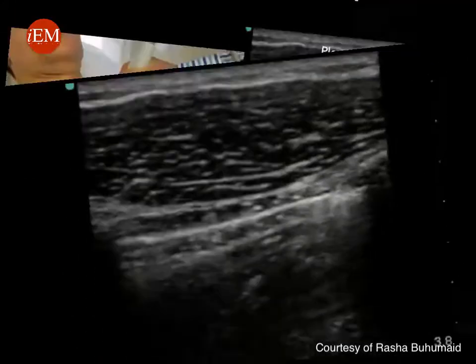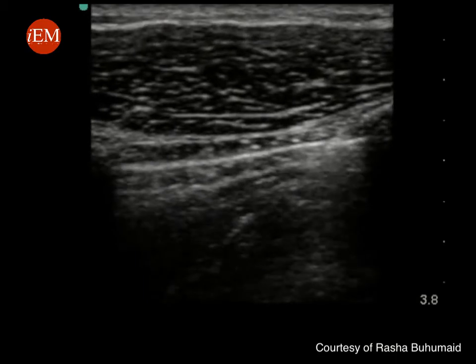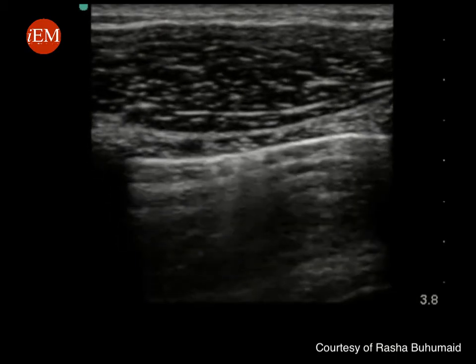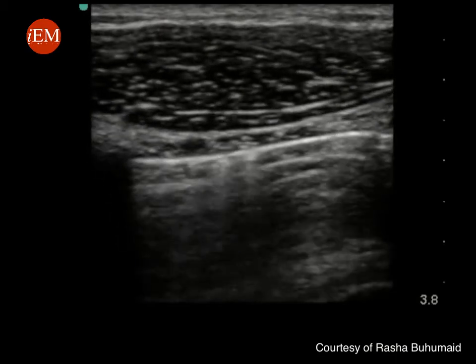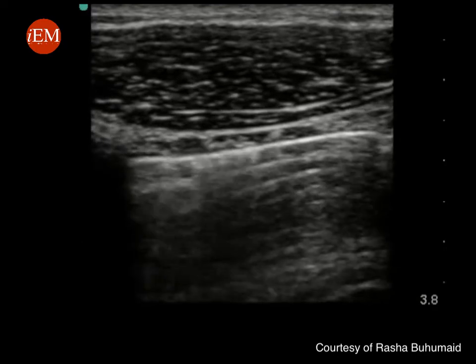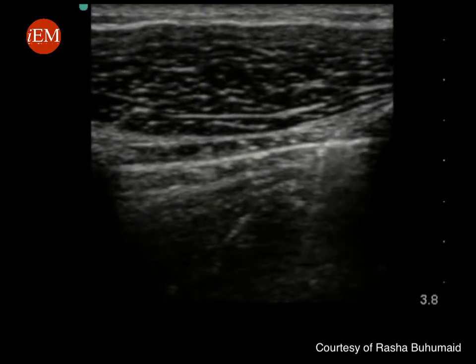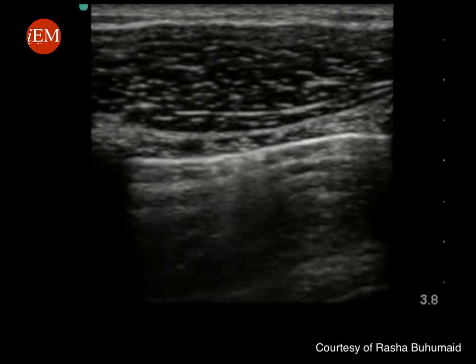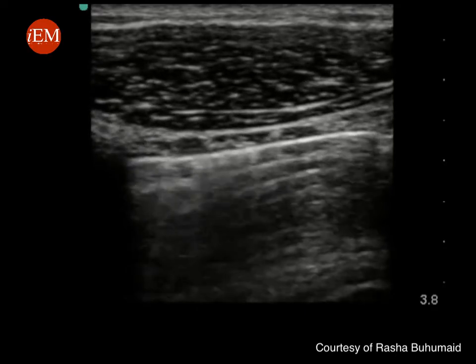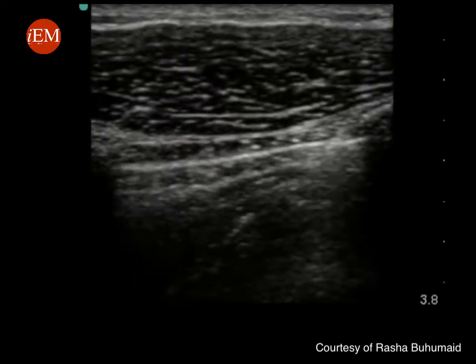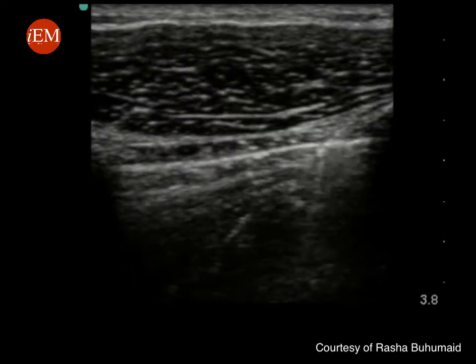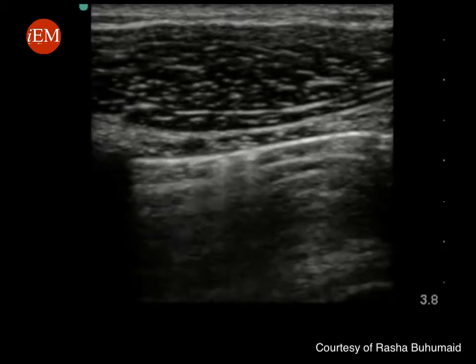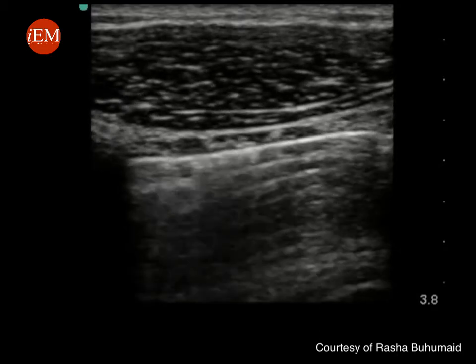This is a normal pleura. Note that the pleura is sliding with these straight comet tail artifacts originating from the pleura. The presence of normal lung sliding rules out pneumothorax.